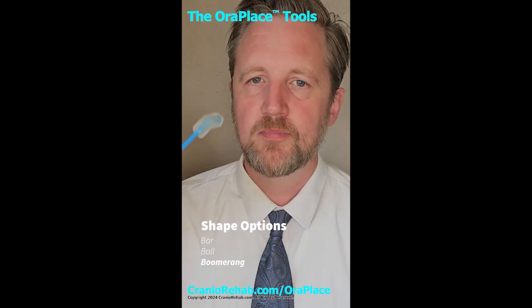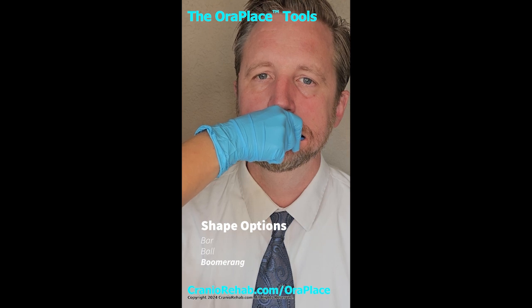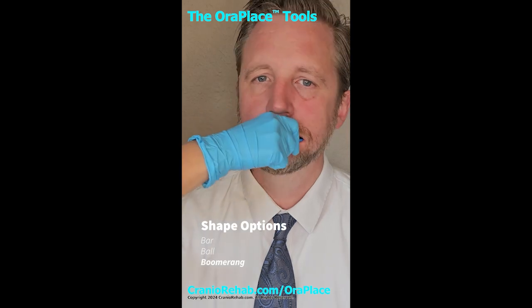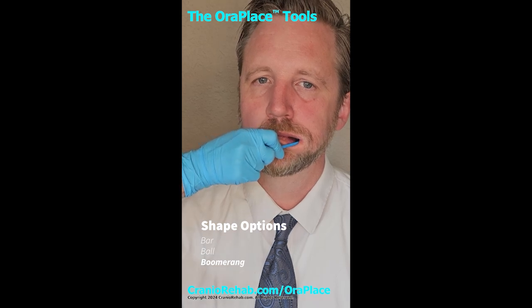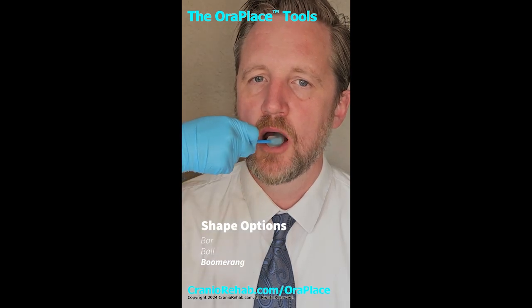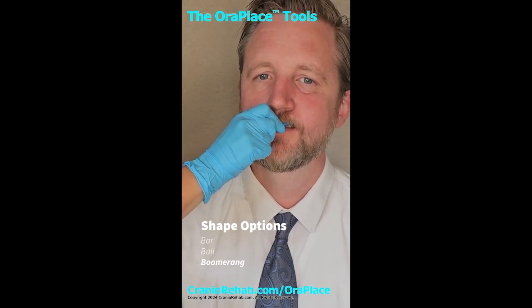All right, so go ahead and open up, Rob, and we're going to target the bottom of the jawline. You can see the nice stretch there. Go ahead and turn to the right. Now, again, if I want to, I can turn that bottom edge outwards to intensify the stretch. Now let me show you up on top. So I'm going to go ahead and insert it again, and I'm going to twist it upwards. So you can go ahead and see that nice stretch there.